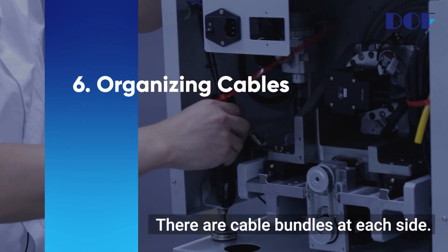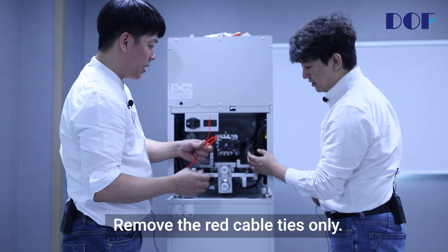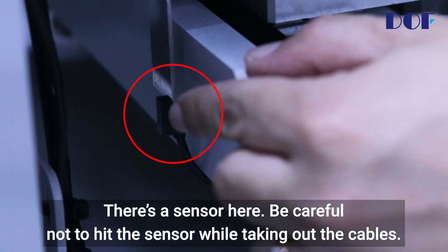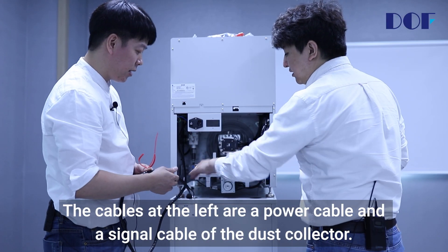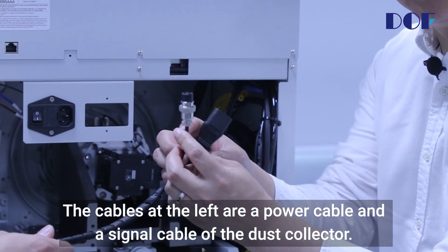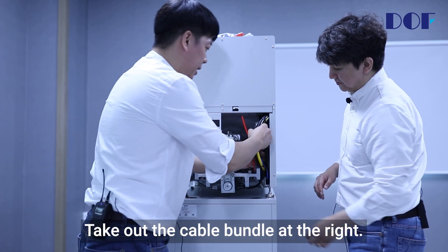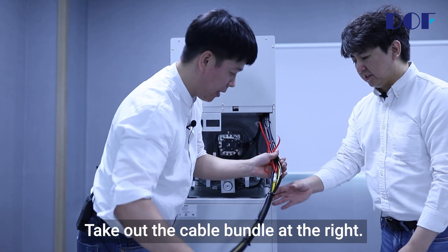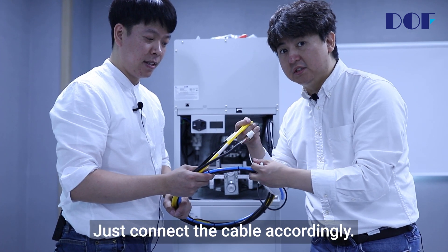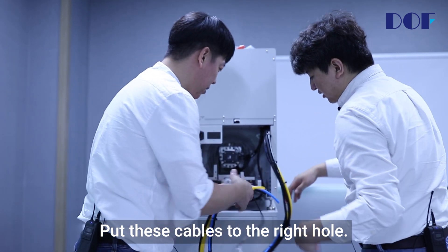Organizing cables. There are cable bundles at each side. Remove the red cable ties only. There's a sensor here — be careful not to hit the sensor while taking out the cables. The cables on the left are a power cable and a signal cable of the dust collector. Put these cables to the left hole. Take out the cable bundle at the right — each cable is labeled, so just connect the cable accordingly. Put these cables to the right hole.